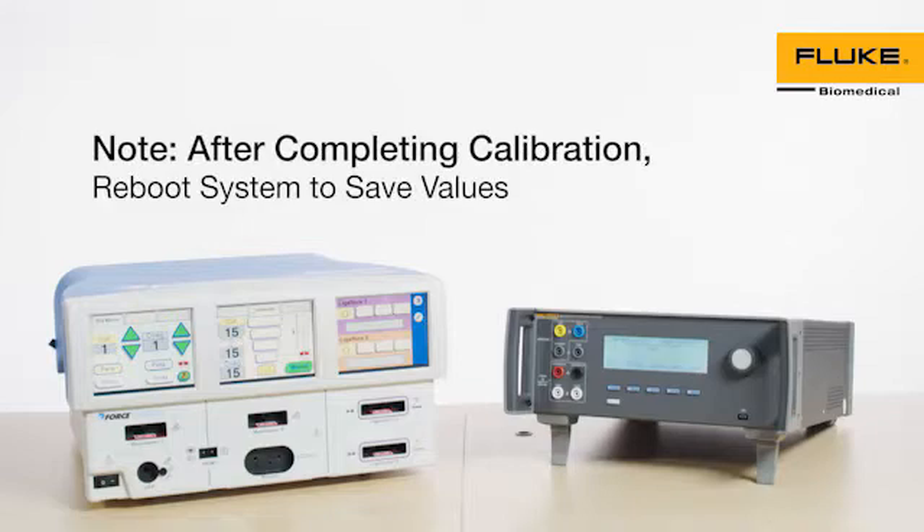Note: after completing any calibration section, reboot the system to save the values from that calibration section. Calibration consists of 10 steps.